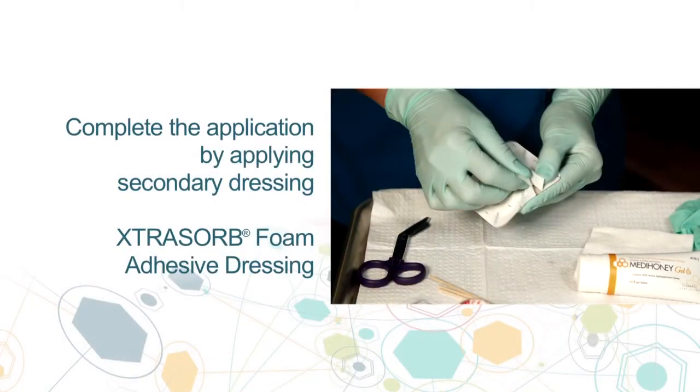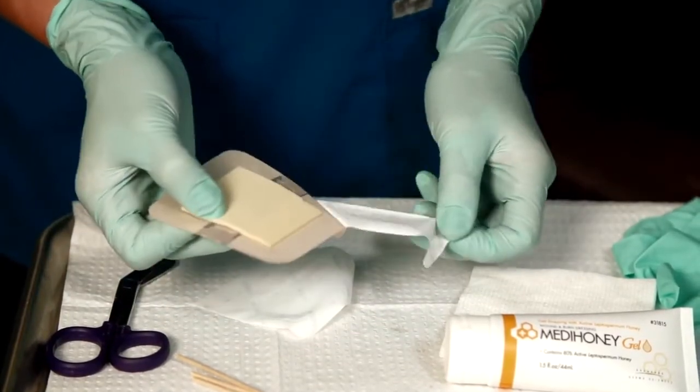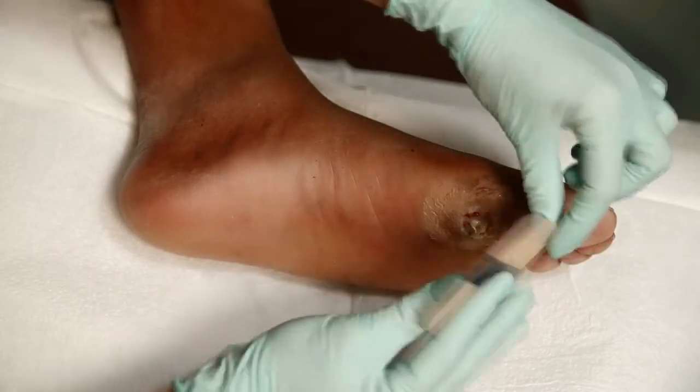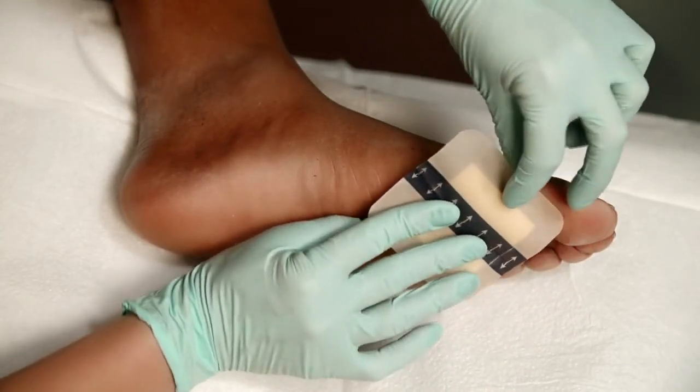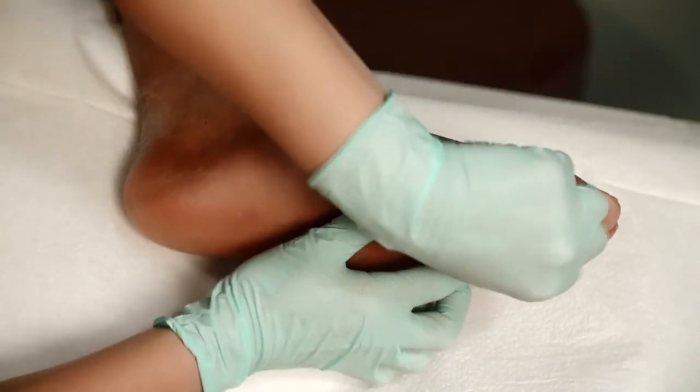We complete the application by putting an extra Sorb foam adhesive dressing to cover the wound site. First, remove the film backing, then place the dressing over the wound. When affixed, remove the top film, making sure all edges are securely in place.